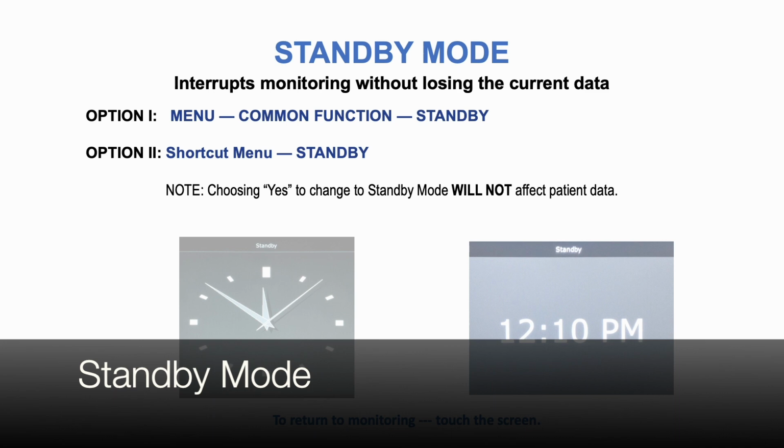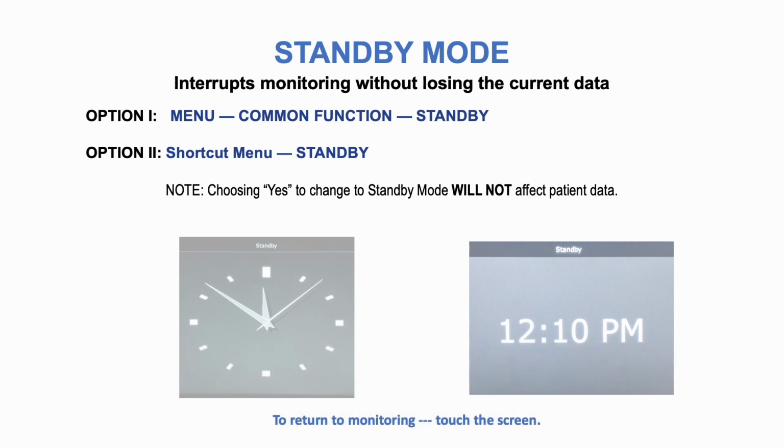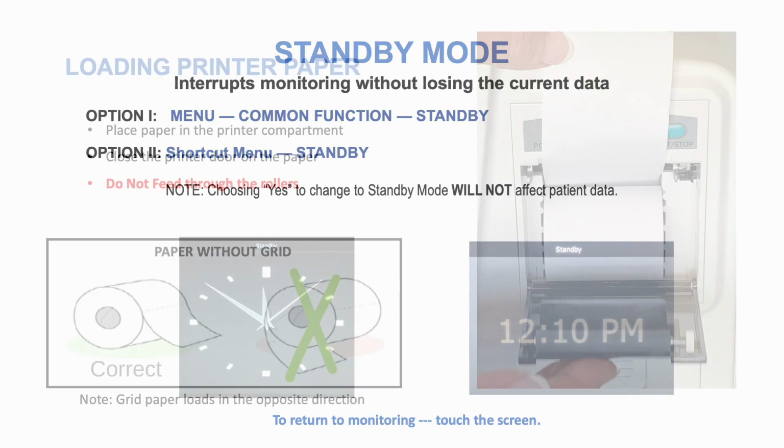Standby mode. Standby mode will interrupt monitoring without losing the current data. Option 1, press or touch Menu, touch Common Function, touch Standby. Option 2, touch Standby on the shortcut menu. Choosing Yes to change to standby mode will not affect patient data. To return to monitoring, simply touch the screen.